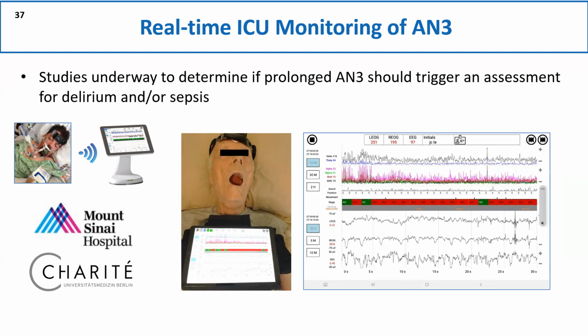And we also take, because it's so important to be able to see the theta delta power, especially if there's sepsis-associated encephalopathy. And what we showed you earlier on is how you can look at the sigma power, for example, when that would be normal in N3 sleep. So we have developed the capability of presenting the power spectral characteristics. And here you can present them up to 2 hours. And so you can independently flip back through the file, seeing the staging that was called at different time scales.